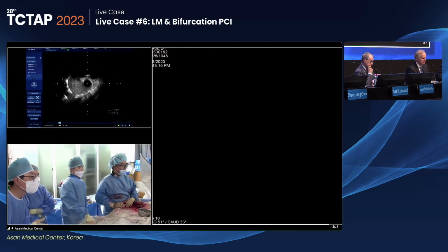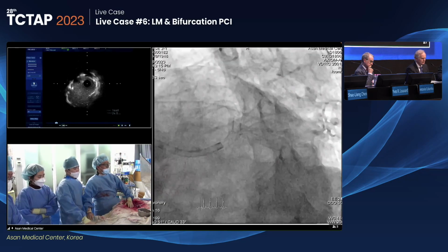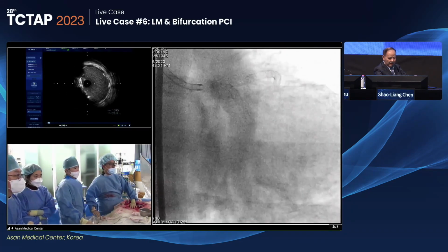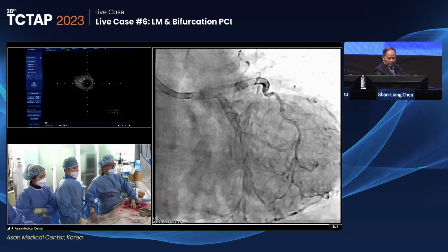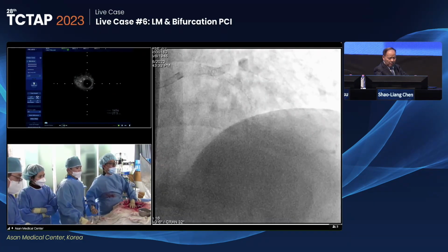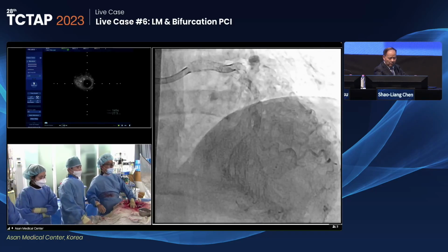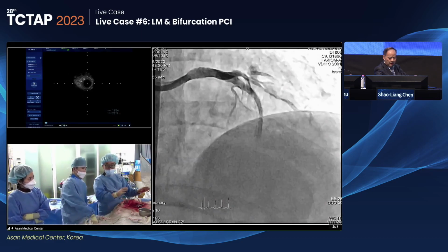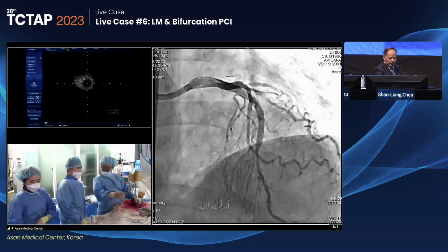Also, can you have your technician focus the IVUS on the ostium of the circumflex? It's good. The struts are good. And then the epicardial view. Okay, good. So I think every vessel I saved, the pre-treatment number of vessels and the number of vessels after treatment, is the same. Could you show the spiral view final?